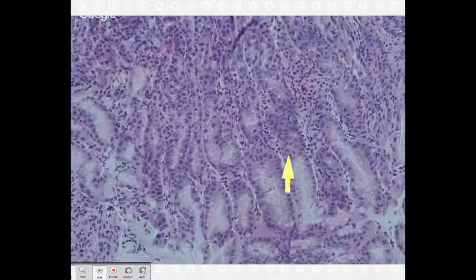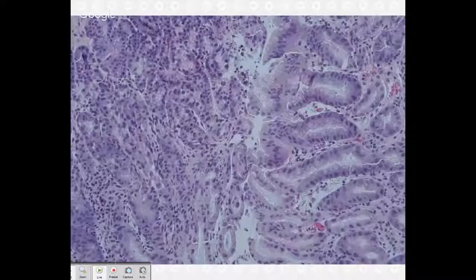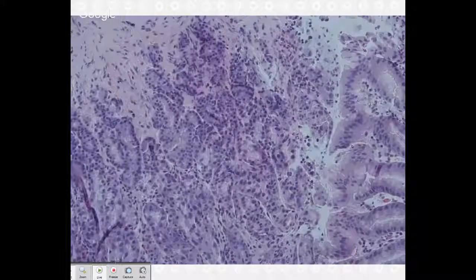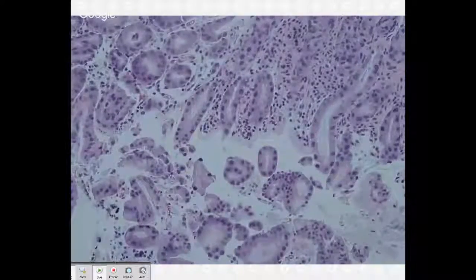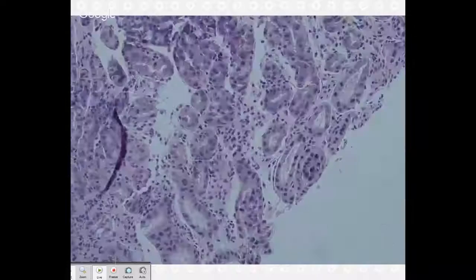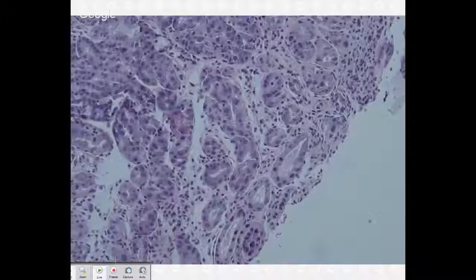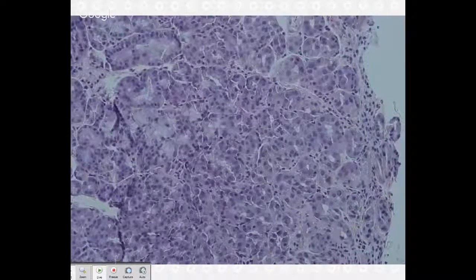So kind of like, oh, there we go. There's a good one. And then if it's this busy, typically in a woman, you look for H. pylori and stuff like that. Sure, so we would think about a Helicobacter pylori gastritis. Did you find Helicobacter? No. Okay, I didn't either. That's good. I'm not too good at that.